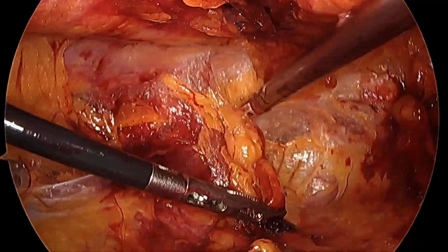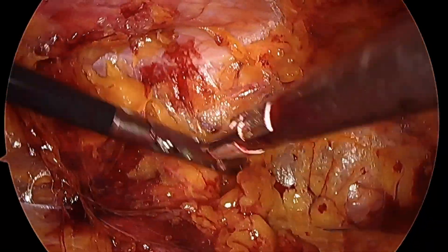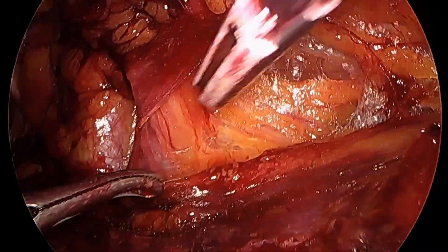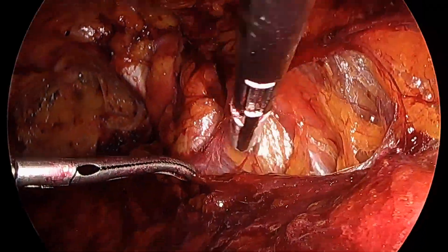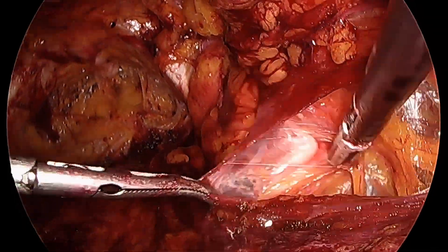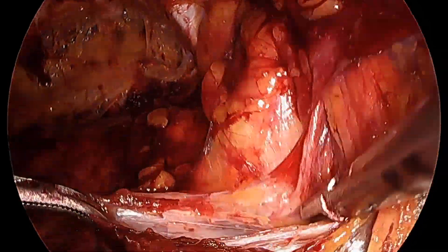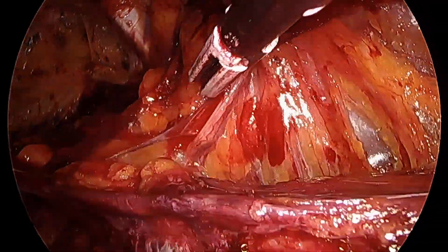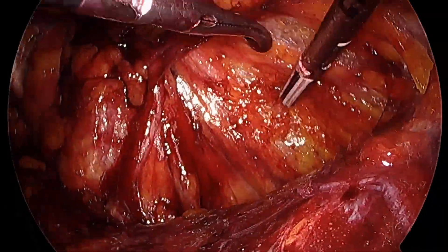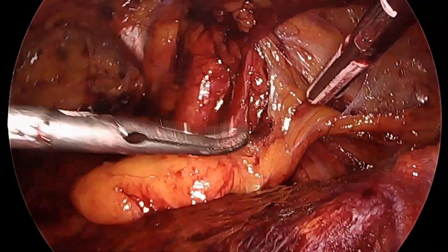Right now we're dissecting in the parietal compartment, superficial to the layer near the bladder where the autonomic nerves are, so the patient doesn't have foreign body sensation with the mesh. We see the vas deferens on the right side and dissect away the peritoneum, creating a nice retroperitoneal flap for the mesh overlap. Now we progress into the visceral compartment and reduce the cord lipoma.